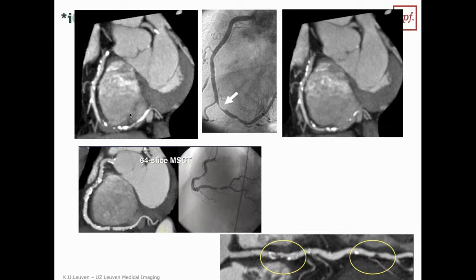One of the things that is so relevant here is you can say, okay, if we have calcium, then we have coronary artery disease. So people have developed what they call calcium scoring to look at the calcium burden of a coronary artery and are trying to link this with clinical disease. And that's done especially in the United States, where they're actually promoting this as a screening tool. You say, okay, with just a very fast CT image, you get an idea of whether you're going to have coronary artery disease, yes or no. The problem is that this is an oversimplification, and this is what happens very often in medicine.